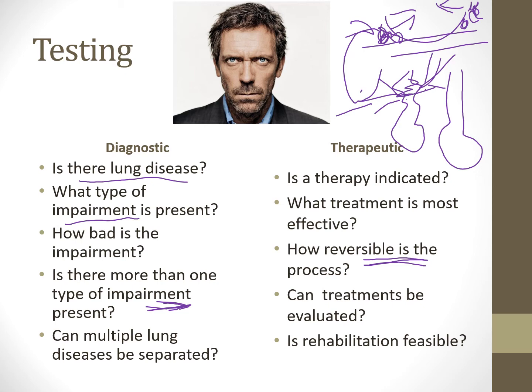So when we're looking at this, we have to look at bringing a patient back up to what their baseline flow rate is. I'm not going to look at what's predicted for them, right? I'm not going to look at what's predicted for someone by their height, gender, and age. I'm going to look at what's predicted for them at their baseline.